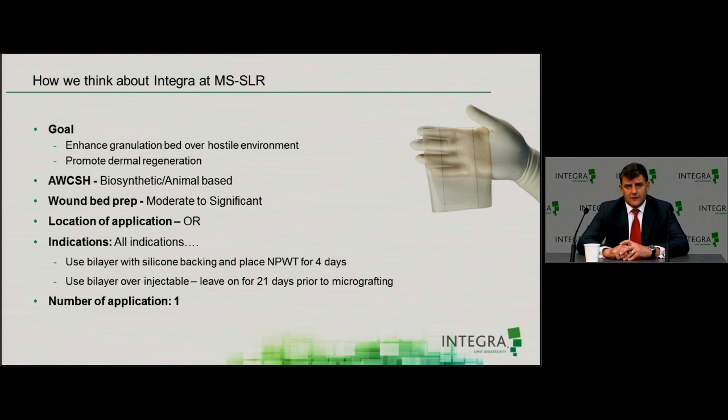And for patients with ulcers or wounds that are certainly bigger than 100 square centimeters, they're going to need a secondary therapy to epithelialize, but they're going to have a much more durable outcome, and that's what we're very interested in. However, I'll be making some comments in a while that when you are using dermal regenerative therapy, it's far superior to many of the other ECM type therapies or even bioavailable therapies where you have to put on multiple applications, because dermal regenerative therapy in general is, as we like to say, a one and done therapy. You put on one application and you get an awful lot of bang for your buck and a good result at that period of time.